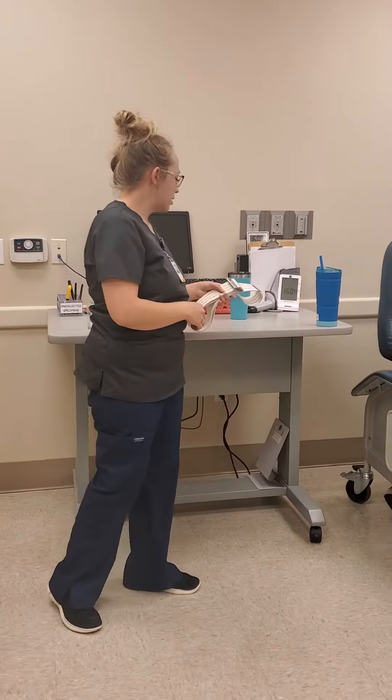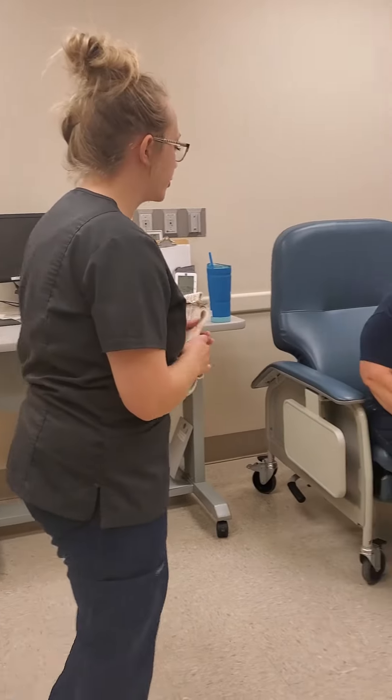This is the gait belt that I'll be using today. My patient is Audrey. I've already confirmed her with her chart and her wristband.